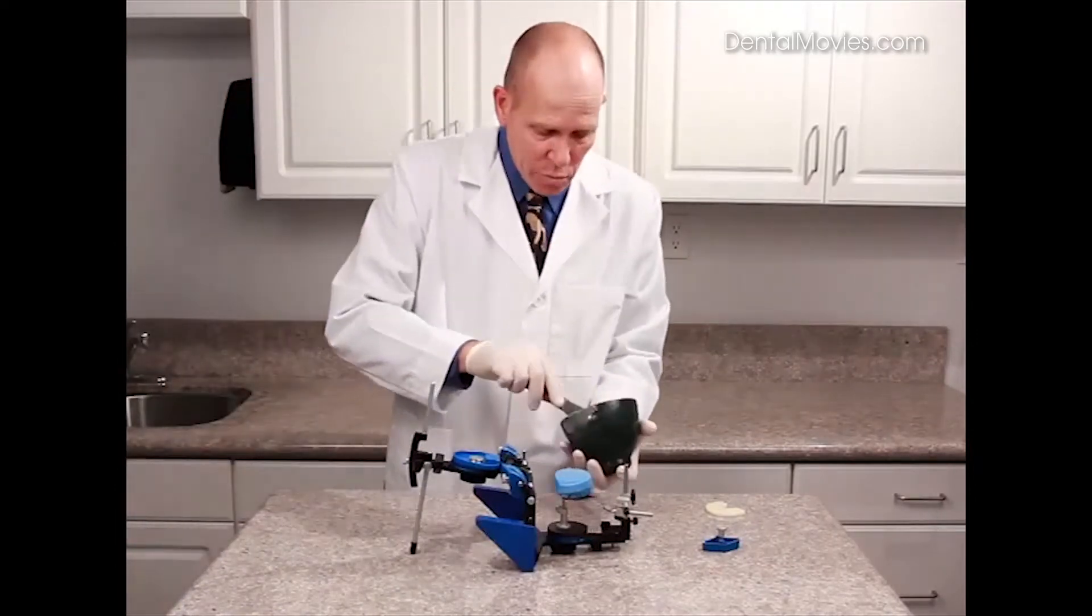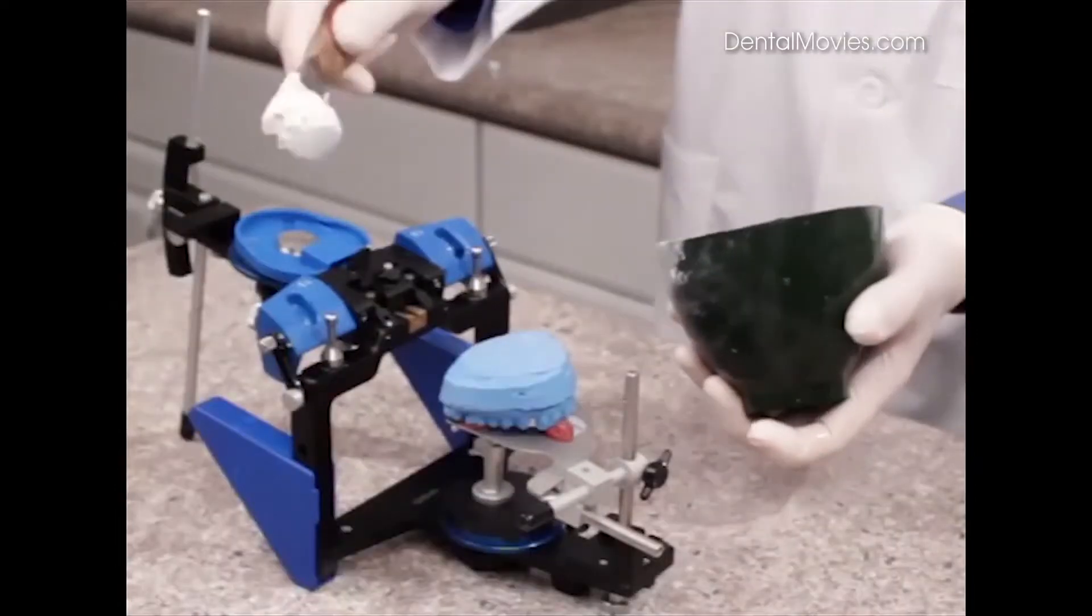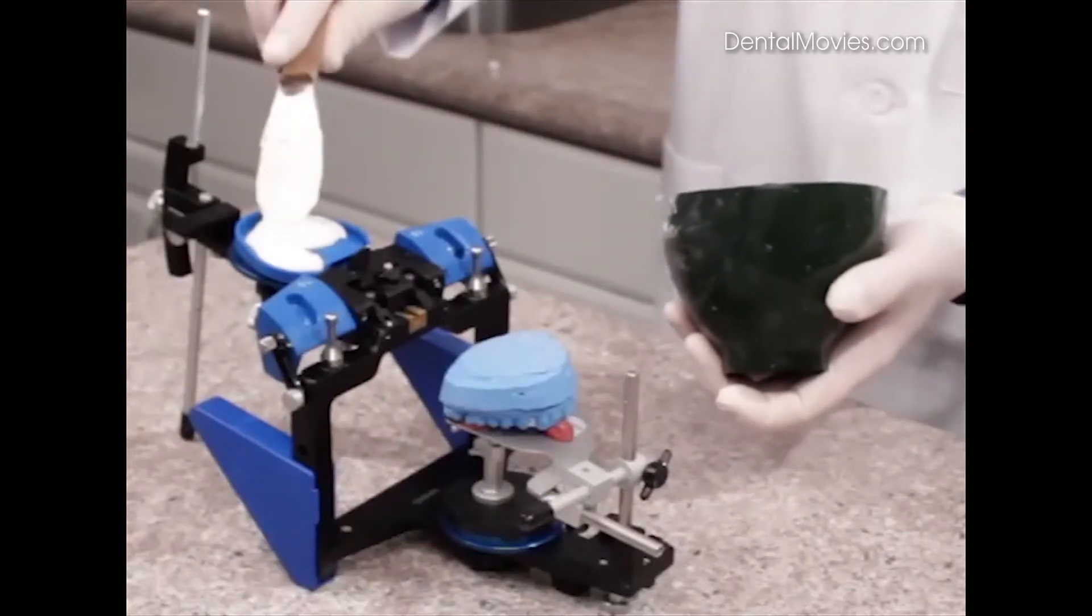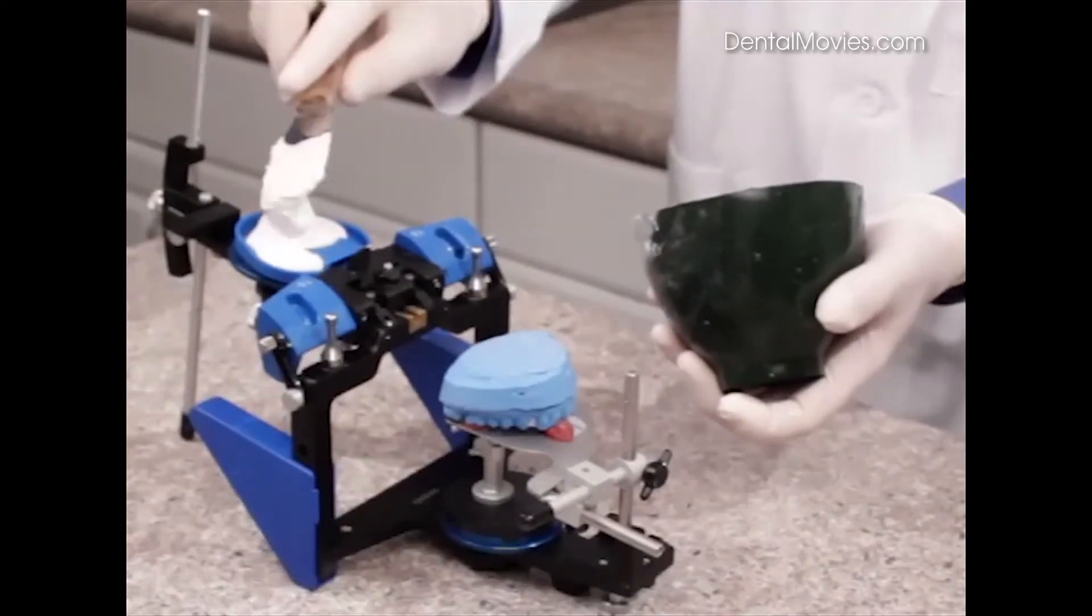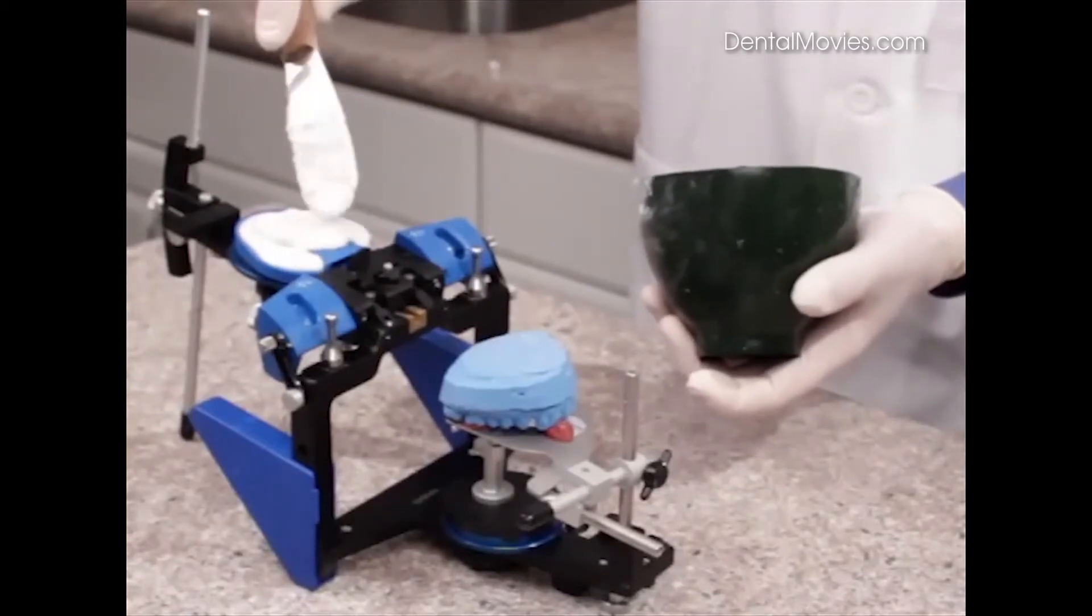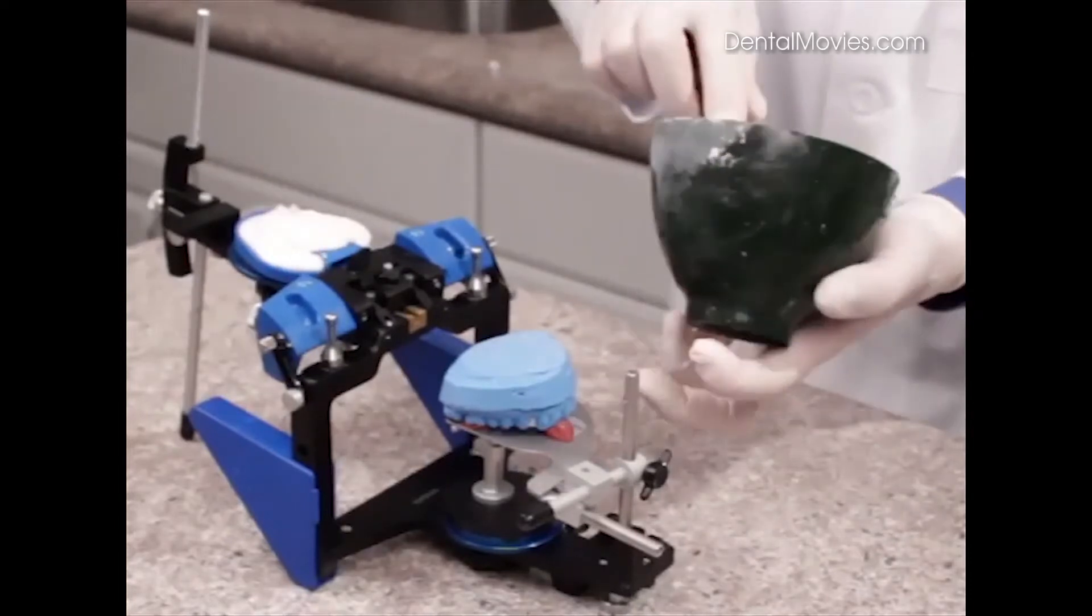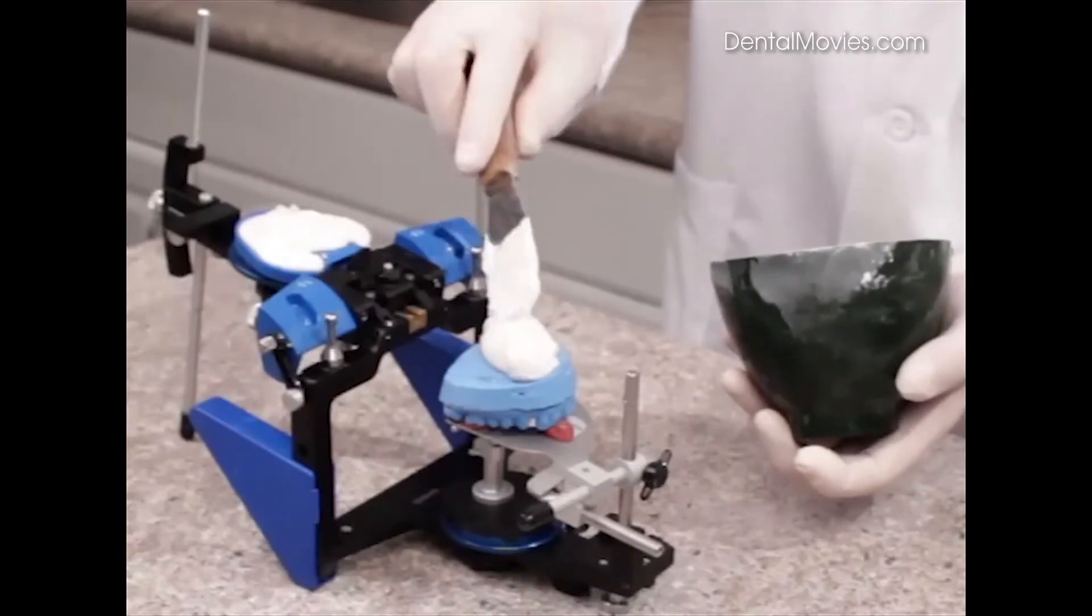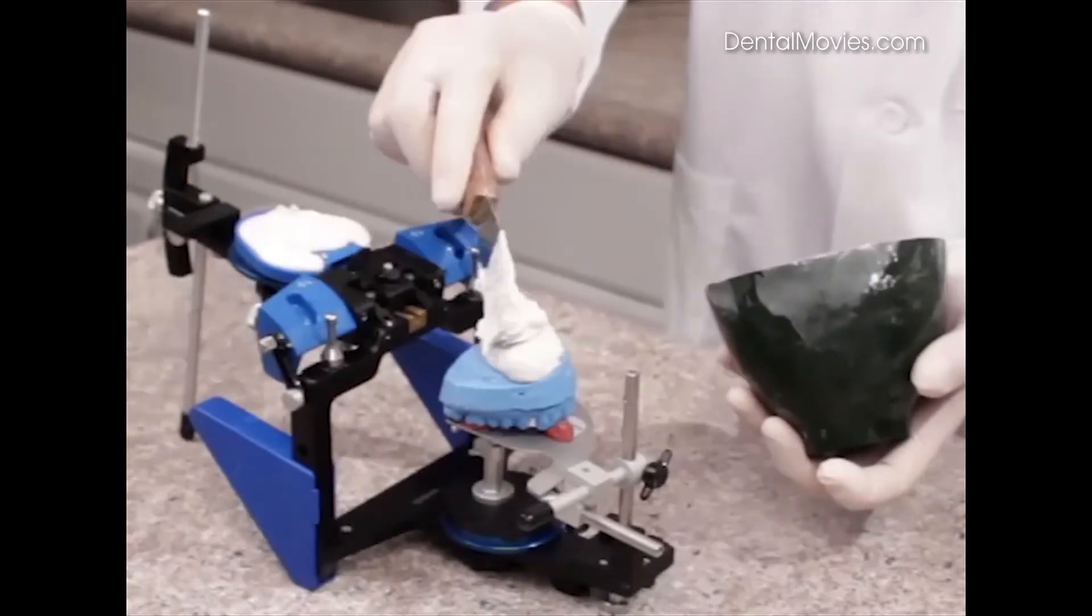Now we're going to mix plaster, and we'll add some plaster first to the mounting plate, make sure we get it around the center retention lug really well. We also want to fill that mounting plate up because we also have some retention tabs along the lateral edges of the plate. So we'll fill that plate up real nice like that, and then we'll add a little bit of plaster here to the model so we can make a connection to the mounting plate.